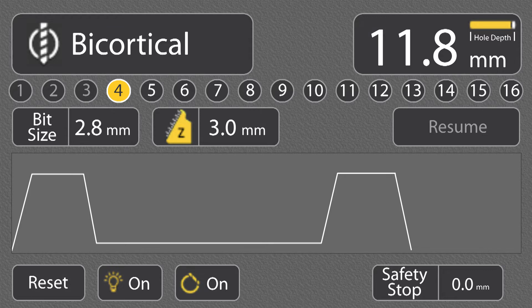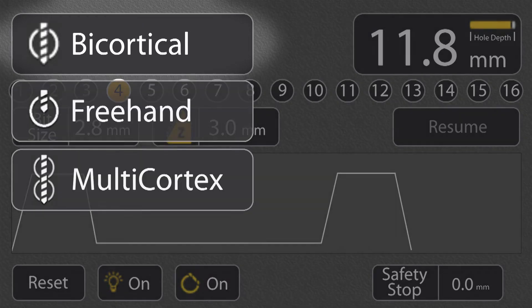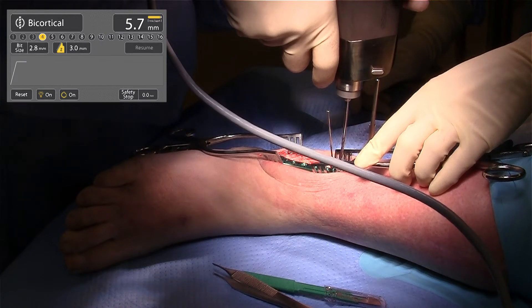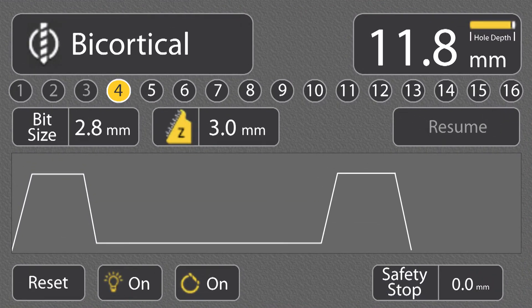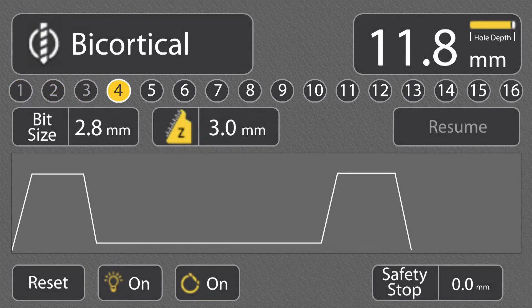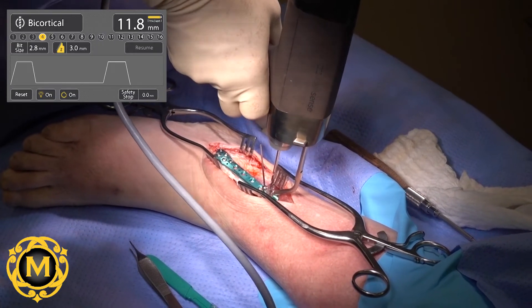Drill settings can be adjusted at virtually any time during the procedure. The IntelliSense drill has several modes, including bicortical, freehand, and multicortex. Bicortical mode is the most used and thus the default setting. In bicortical mode, the IntelliSense drill will automatically stop drilling when the second cortex has been breached, helping to prevent plunge injury to critical surrounding structures. The drill continues to track data for each hole drilled; should the surgeon desire to review data from a previous hole, simply select that hole number on the controller display. Using bicortical mode, a fourth hole was drilled in the proximal portion of the lateral fibula plate, and the graphical display illustrates the two bone cortices.